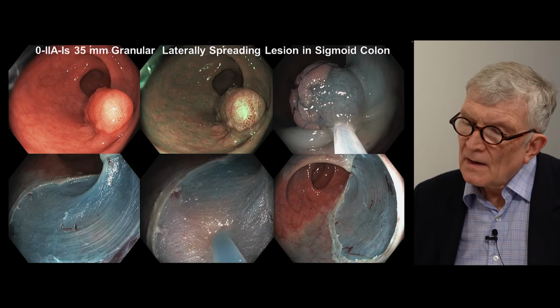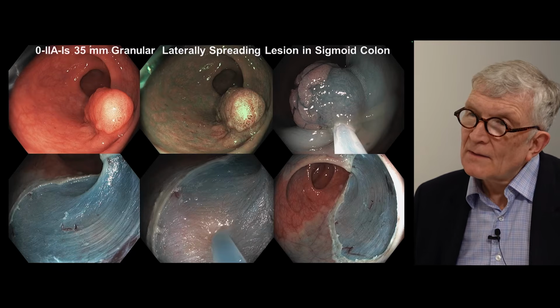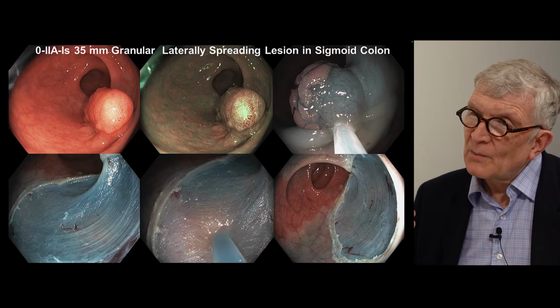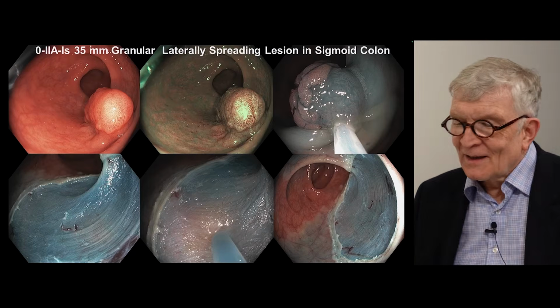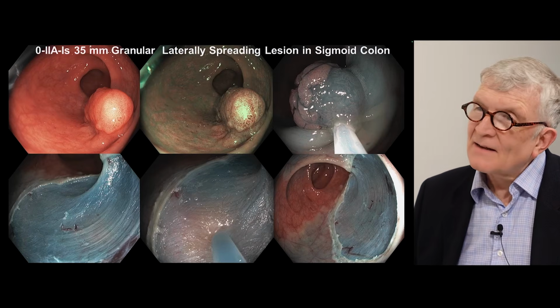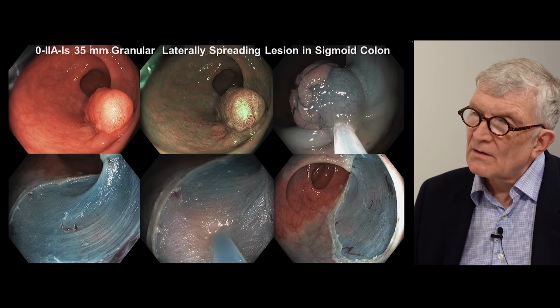So that means in your classification, if you name this a type 1, you make this a type 0 again by... Yeah, that's true. That's true. Yeah. Okay, yeah. Good. And if it doesn't stain, is that worrisome? If there are no whitish damage occurring?